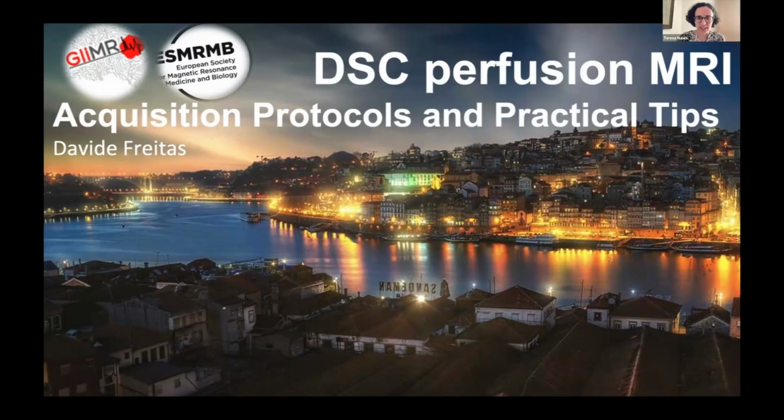And I think I will have a final question that is regarding clinical applications. Do you consider DSC perfusion to be reliable for detection of pseudoprogression? Tumor recurrence or progression within the radiation field can sometimes present with low rCBV, while cases labeled as pseudoprogression may also show elevated rCBV.